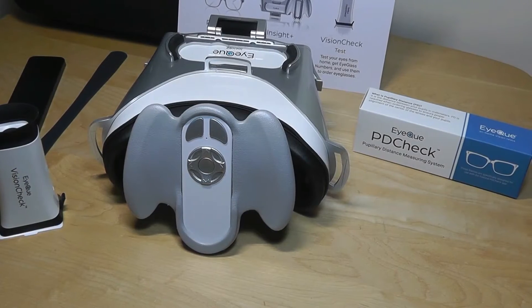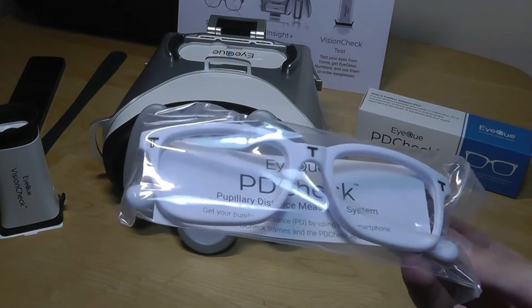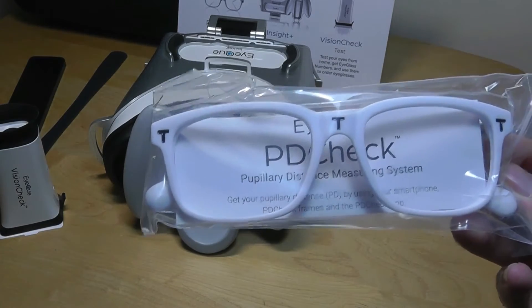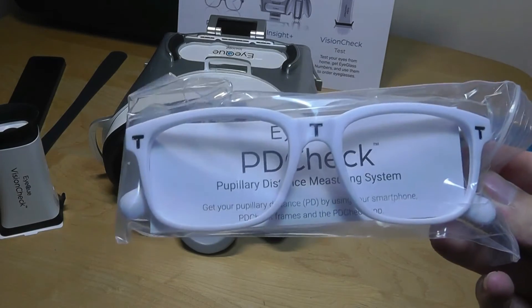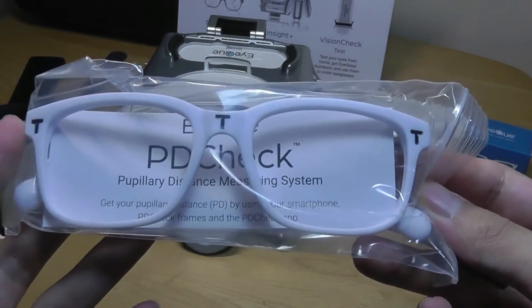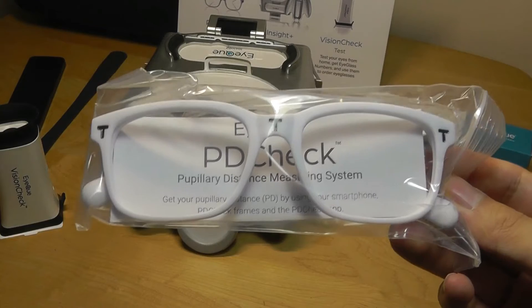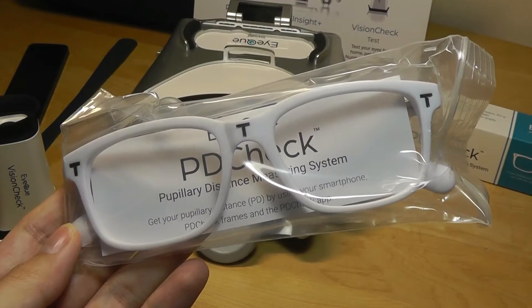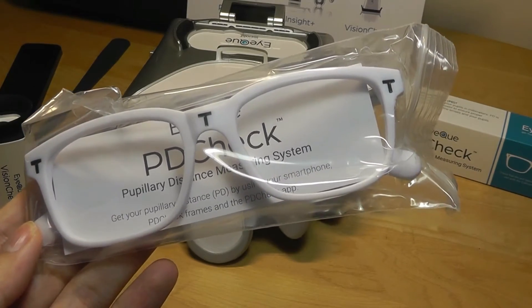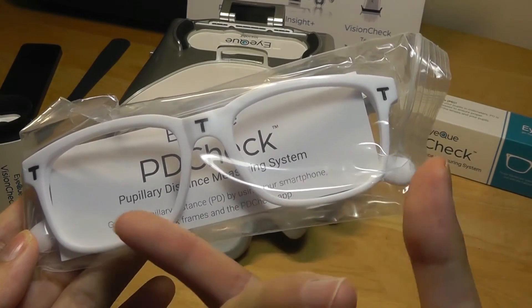Finally, the PDCheck measures your pupillary distance using what looks like a simple plastic pair of glasses. Using the app, it detects how far apart your two eyes are — another number needed when ordering prescription lenses. It does this using three T-marks across the top of the frame. When you open the app it takes a selfie, then relies on augmented reality to measure how far apart your eyes are, calculating the relative distance because the manufacturer knows the exact length of the glasses frame.